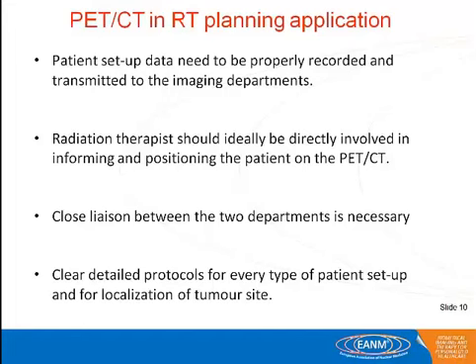We really need a close liaison between the two departments and clear, tailored protocols for every type of patient setup, for localization of the tumor site. So we really need to know what's happening in the radiation therapy department, and to have a good PET-CT imaging.